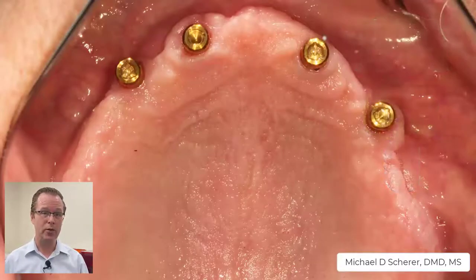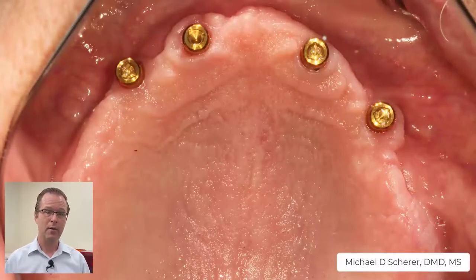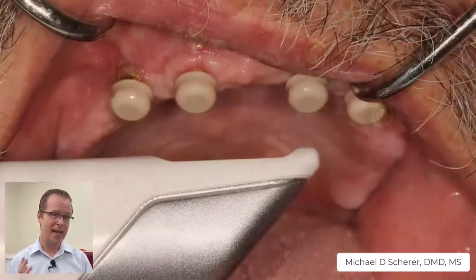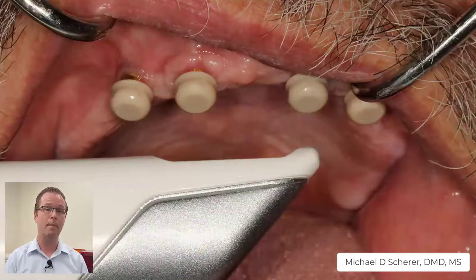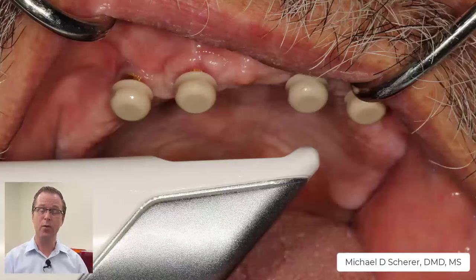We have a patient here in my practice that has a maxillary four-implant overdenture, with locator abutments placed approximately in the 6, 7, 10, and 11 regions of the maxillary arch. He's got a pretty flat and broad palate, which is oftentimes a little bit more difficult to scan. We've gone ahead and snapped the locator scan bodies onto the locator abutments after they've been torqued down and radiographed to confirm fit. Now we're ready to go ahead and get scanning.